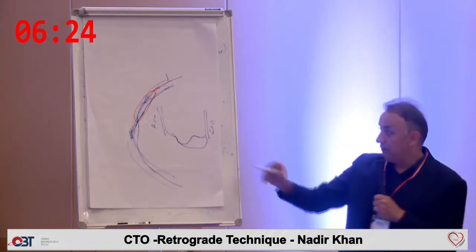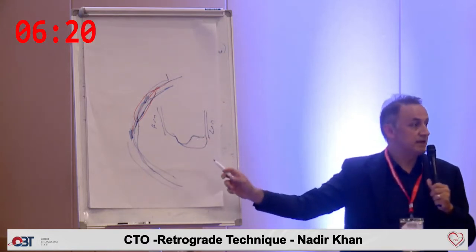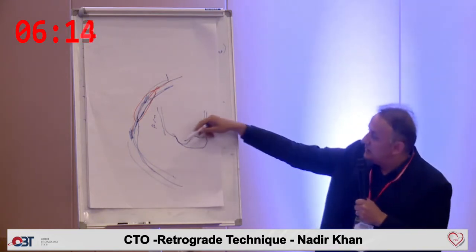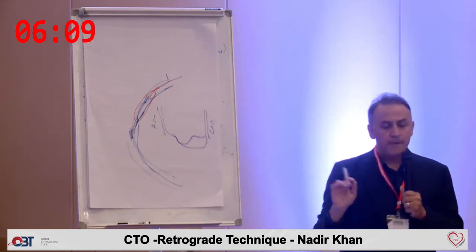You have to be careful. If there is an angle like that, you have to check this angle. If you push more, you will perforate, and your microcatheter will be like that. It means that you perforate. You should know that it's perforated.